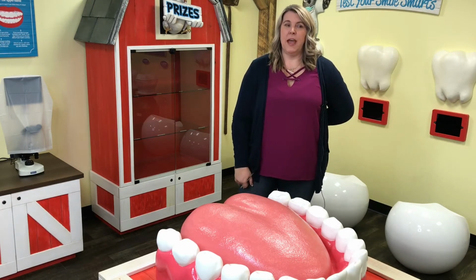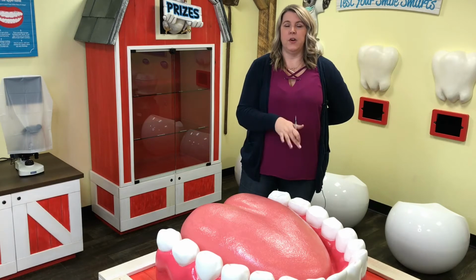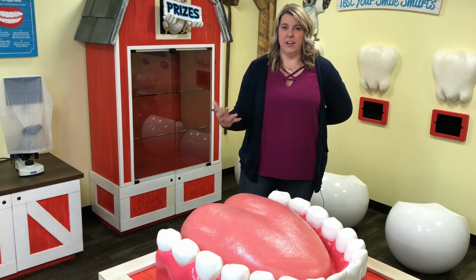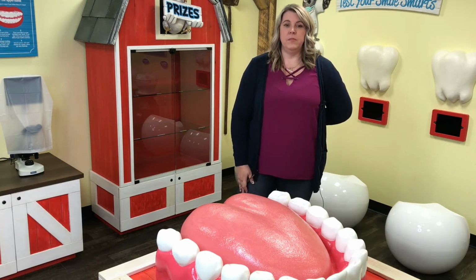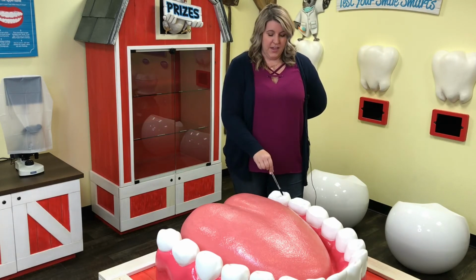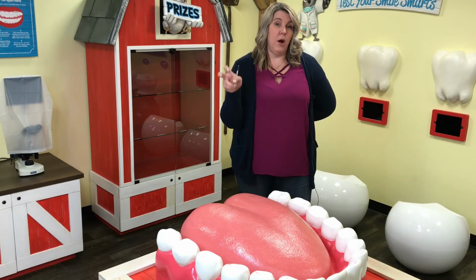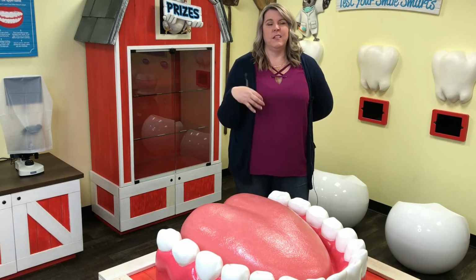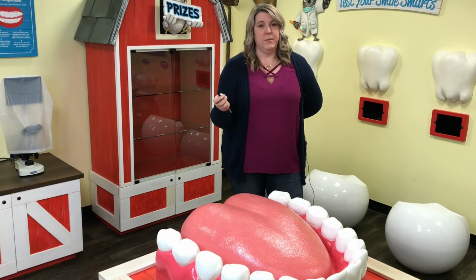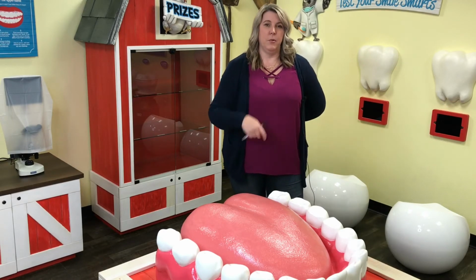It is considered somewhere between a cleaning and a treatment, because it is a little bit more than a cleaning as far as the setup. But it's not like an actual treatment like a filling or a crown, as in they don't need an injection or anything like that, okay? The material they use is a flowable liquid material that is put into the grooves of the teeth, and then that is hardened or cured or bonded to the tooth by a curing light. So it's a lot like putting nail polish on. That's how I describe it. It's how a lot of girls in the office describe it to the kids: you're going to put on the layer of polish and then dry it with a light. So it's kind of that same process.